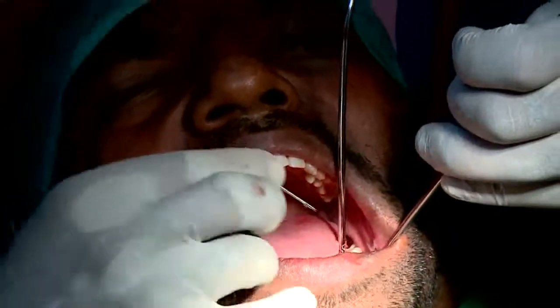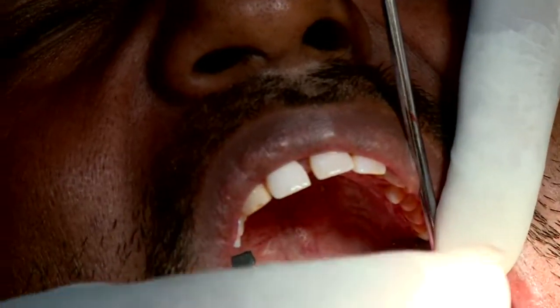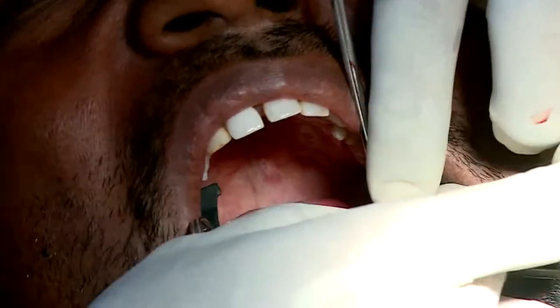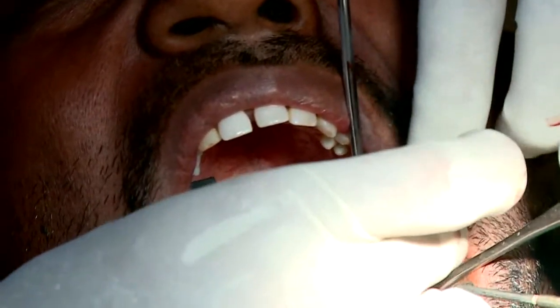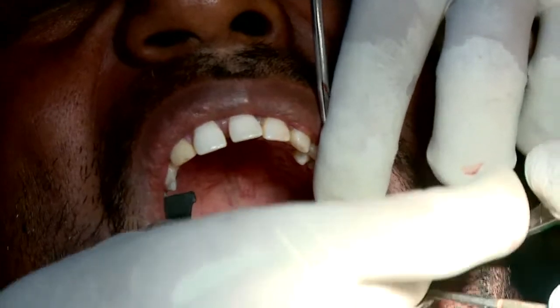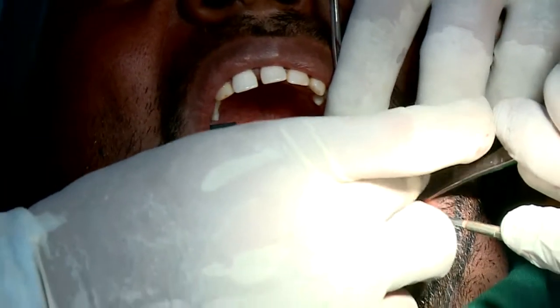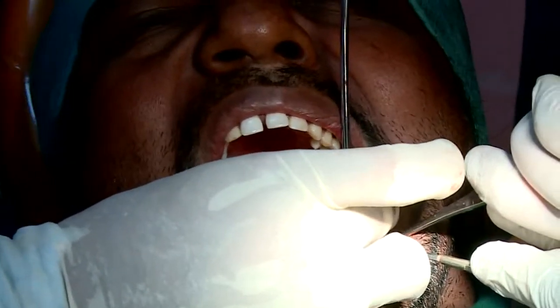All you have to do is place your cover screw straight into the implant site, at the same angulation that it went, and just finger tightening is more than sufficient, because a cover screw is never tightened with your ratchet.